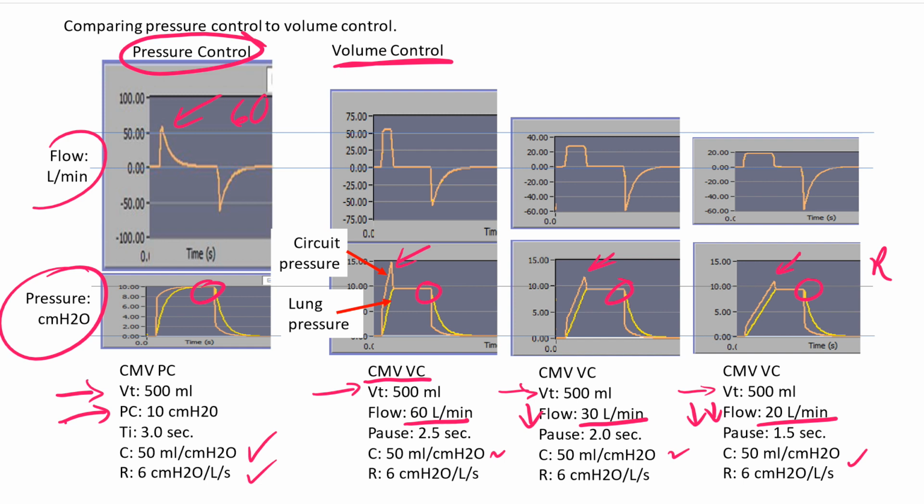All right, I've controlled the inspiratory pause on this so that our TI, as established on the ventilator, is 3 seconds in all conditions. All right, so the time for the TI is being maintained. Our tidal volumes are being maintained. Our mean airway pressure is being maintained. The only thing that's changing is our peak or our flow rates. So in each case, we are using lower flow rates, achieving the same tidal volume, the same minute ventilation, the same mean airway pressure, but we're dramatically decreasing those shearing forces, is what I'm suggesting, by limiting our inspiratory flows.